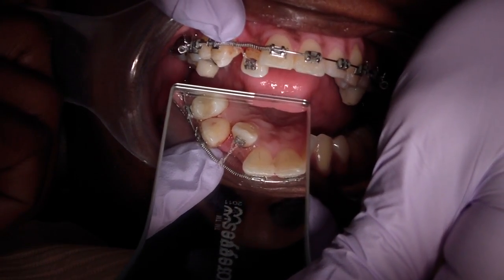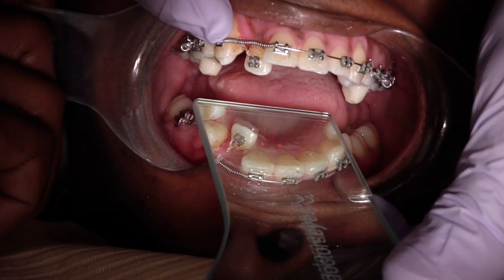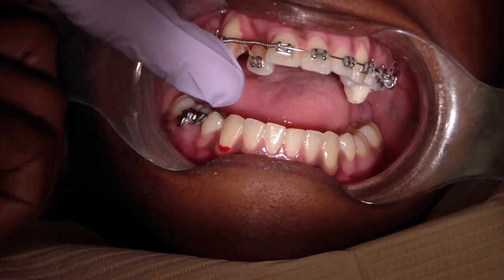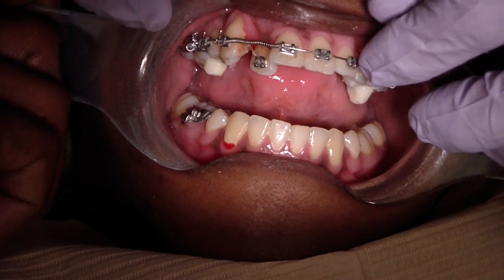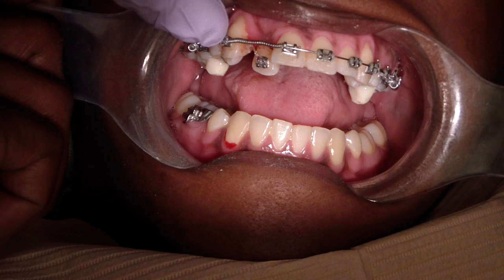There's a thousand different ways to achieve the same result. One way: just place a ni-ti wire, .014 ni-ti, onto the bracket and bring the tooth facially.